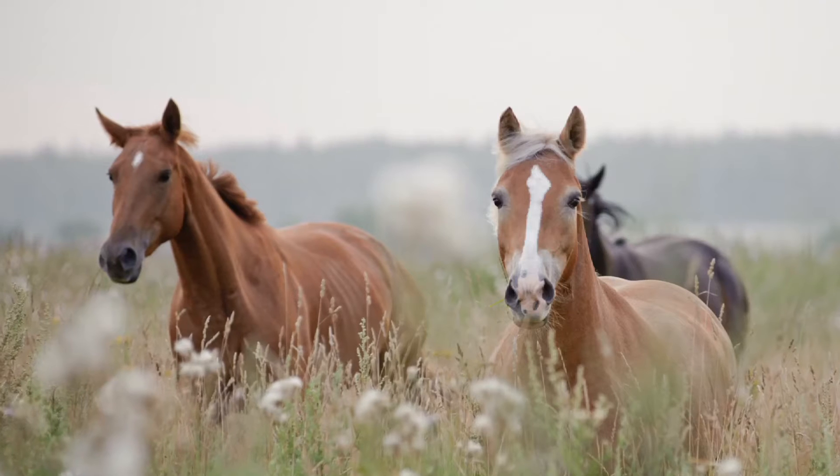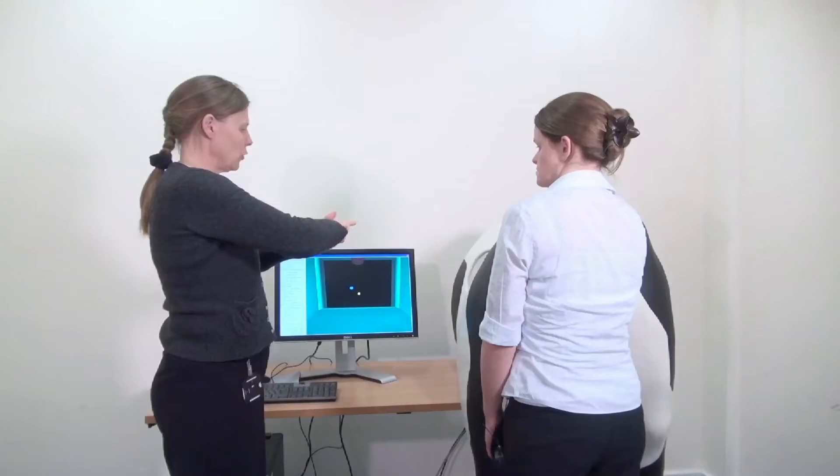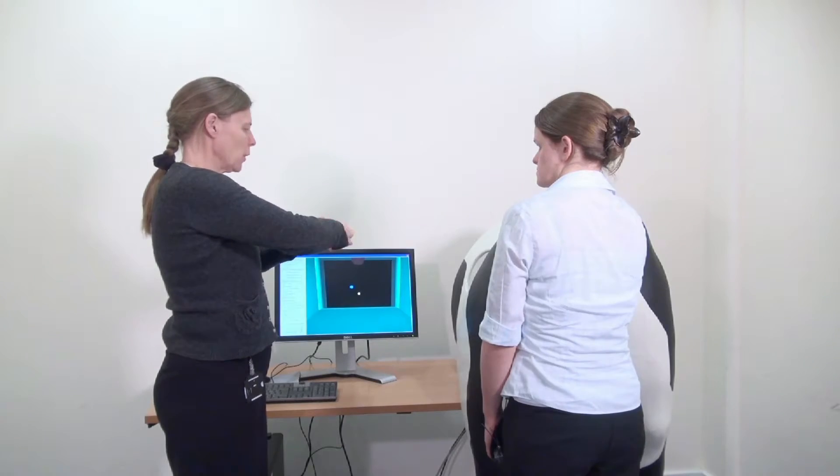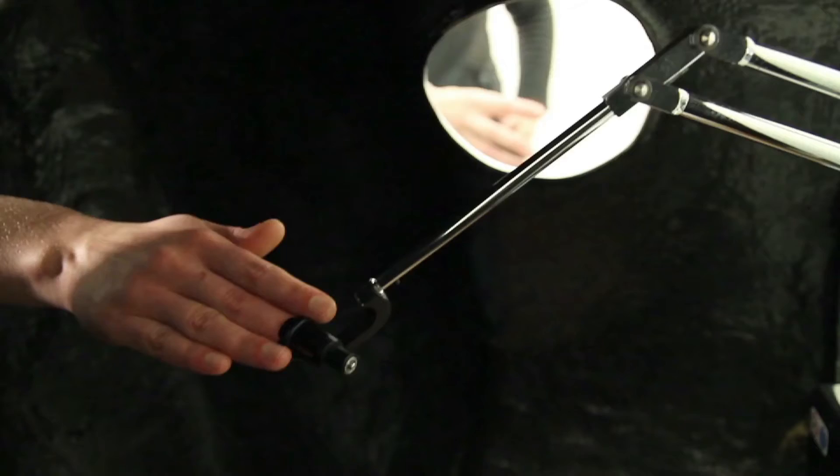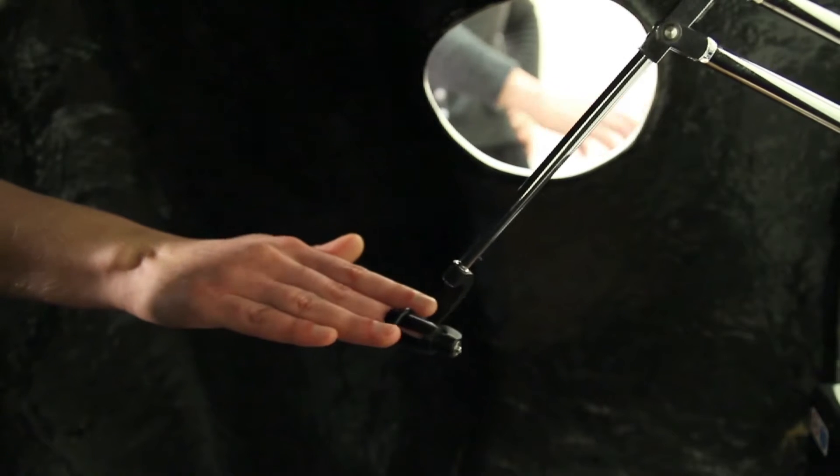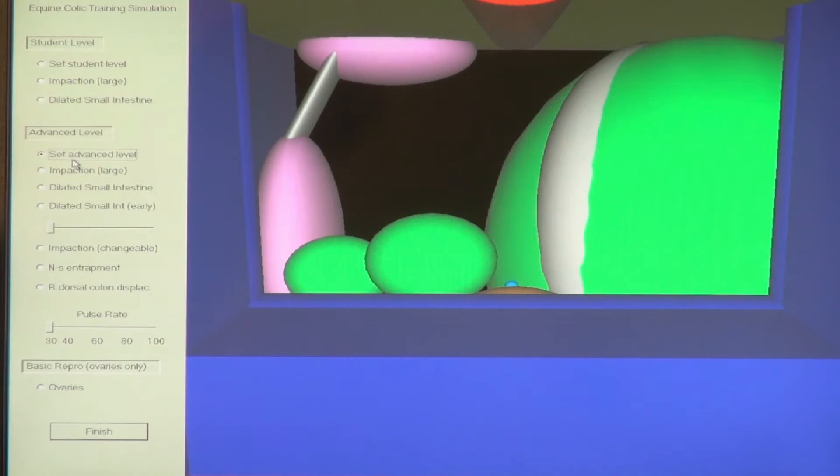The haptic cow and the haptic horse systems draw on virtual touch, or haptics, and enable students to carry out virtual rectal examinations on cows and horses, with their movements being monitored by their instructor.